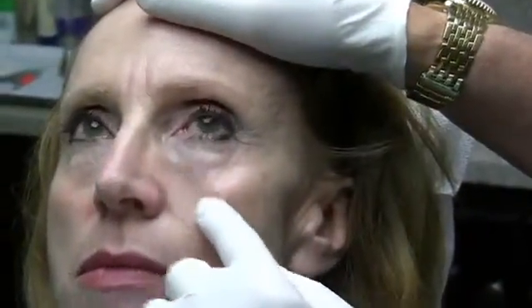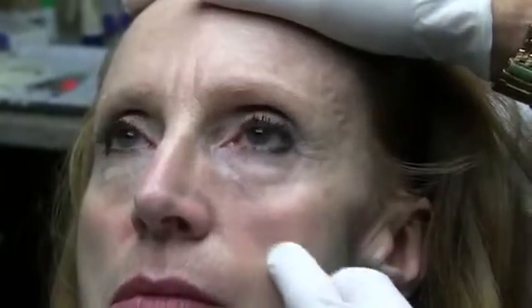She also has atrophy in the infraorbital region and in the tear trough region, and some submalar or infraorbital atrophy as well. Just by displacing some tissue there, you can see how that improves the situation. And she has a little bit of a dorsal hump, which makes her a good candidate for some filler rhinoplasty. So step A is to do our marking and anesthesia, and then we'll do our actual filler.